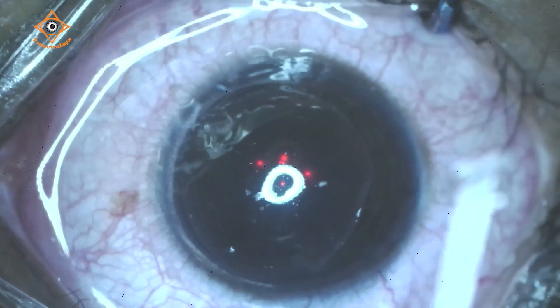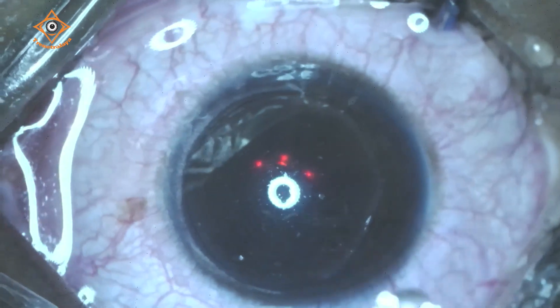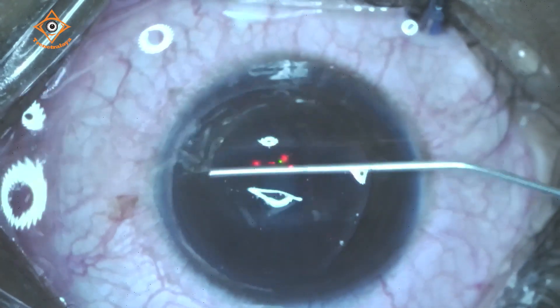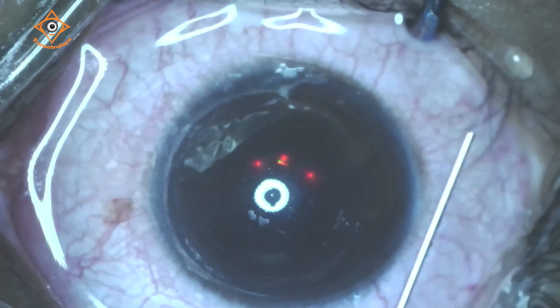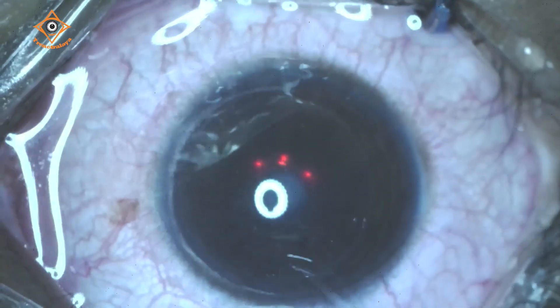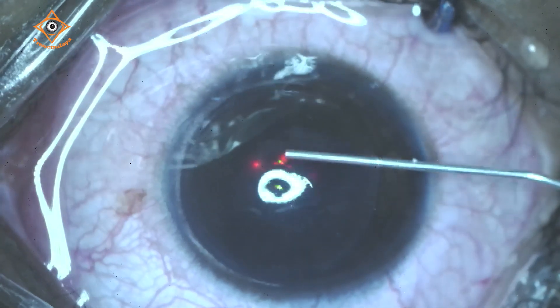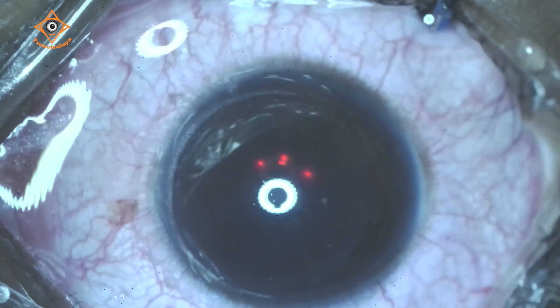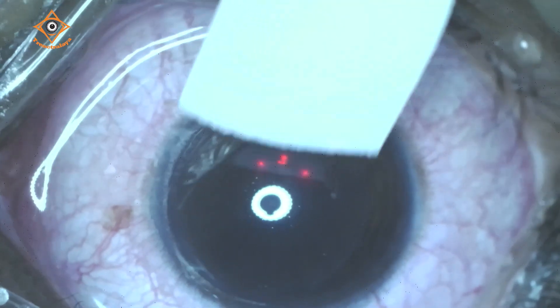We have been using the MEL90 for the last one year and the results have been quite good and gratifying. There is no problem at all and there were no surprises. One of the best parts is the speed at which pupil tracking happens as well as the speed of laser delivery. Patients are quite comfortable and cooperation is very nice. Very well done, Dr. Sagar — a big cheer for him.